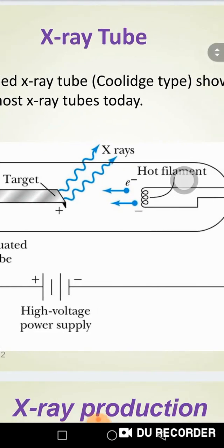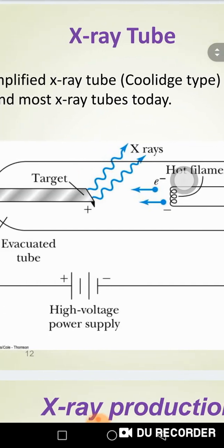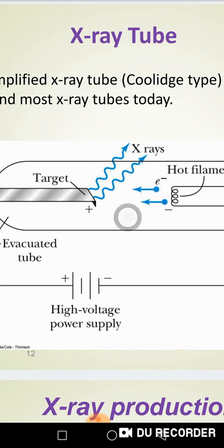Will these electrons burn themselves out from the cathode to the anode? No, the process requires a voltage difference. It needs high voltage to create a voltage difference between the cathode and the anode, which starts to accelerate and move the electrons. Consequently, X-ray production begins.